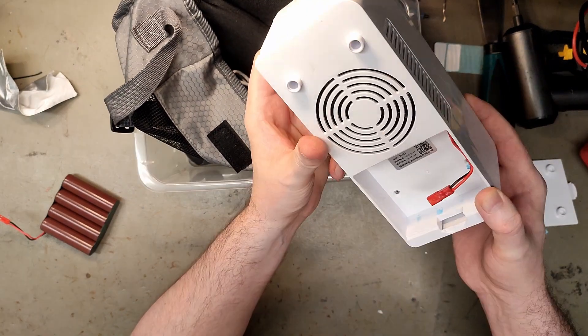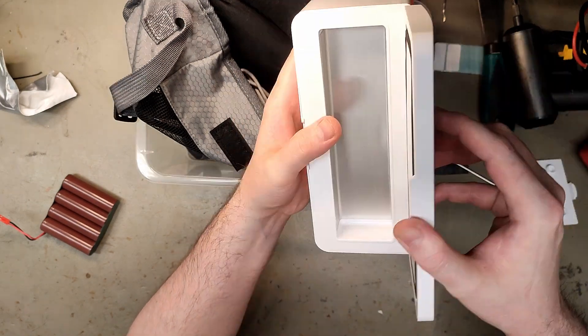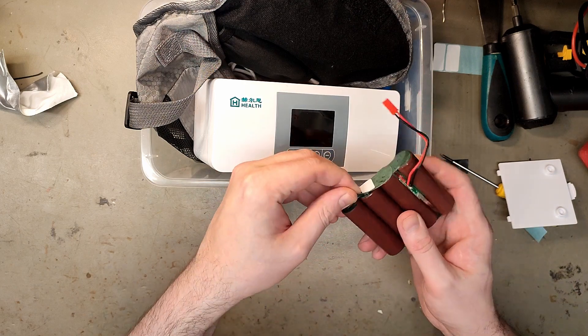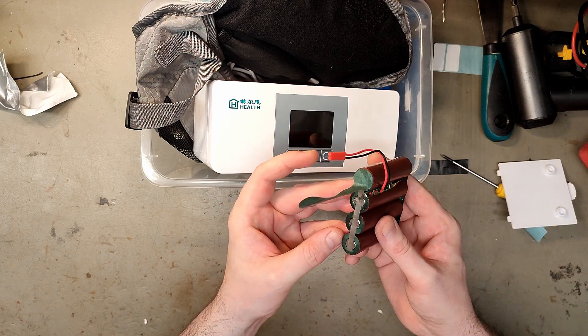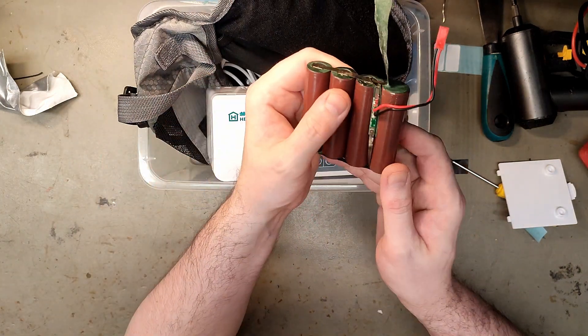Opening it up, I doubt it's a real refrigerator with gases, but maybe it works. The battery is the exact same color as some LG cells but is definitely generic Chinese. They actually have a BMS — why do they have a BMS? This product should of course have the BMS built in.